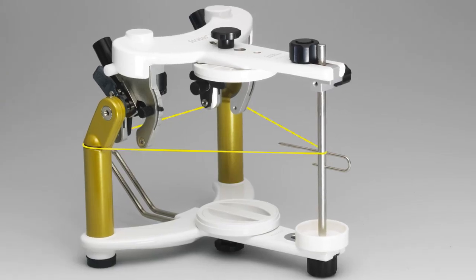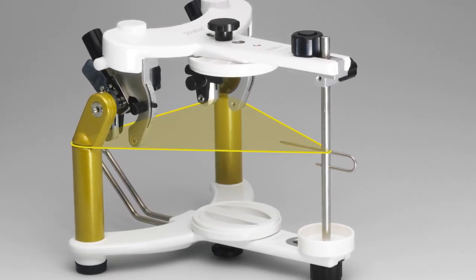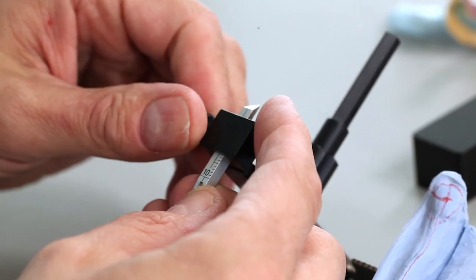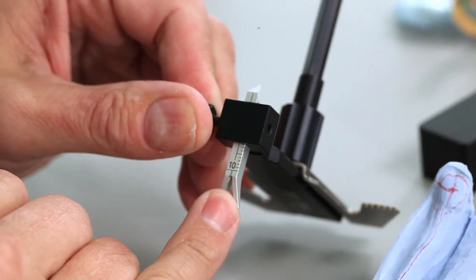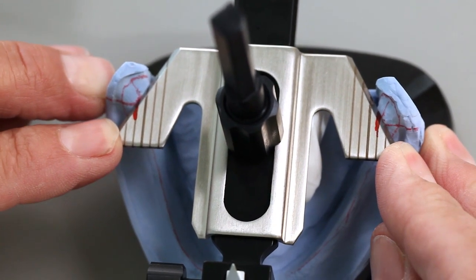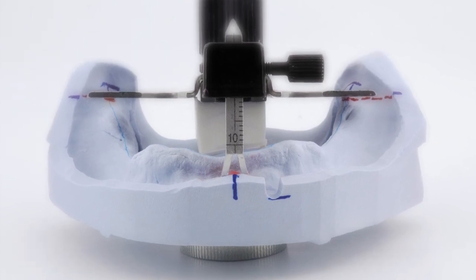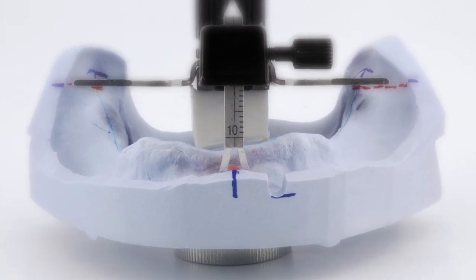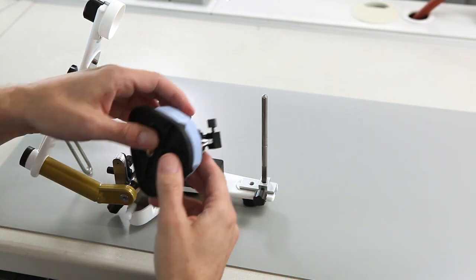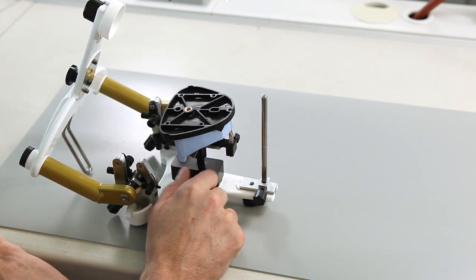The horizontal guide supports the average value model orientation of fully and partially edentate or edentulous models within the Bonwell triangle of the articulator. Set the symphysis fork of the horizontal guide to half the intervestibular distance. Make sure that the side wings are aligned bilateral to the half of the retromolar pad. The fork sits on the lowest point of the mucolabial fold, oriented according to the midline. Mount the horizontal guide in the articulator with the help of the instrument carrier.